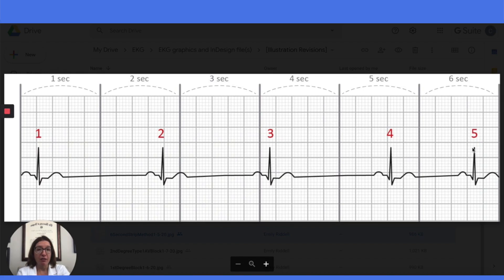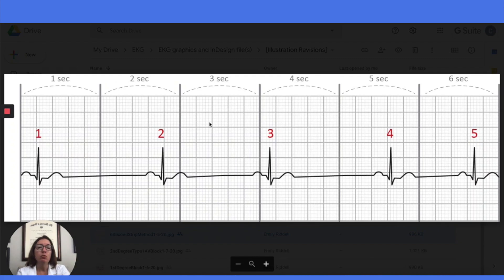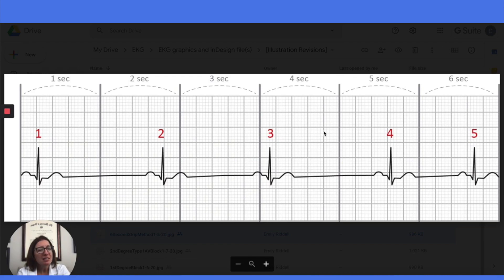I do want to offer one caveat. There are some sources and instructors who want you to count cycles as opposed to QRS complexes, which will in some cases give you a different result. If we were counting cycles, starting here — one cycle, two cycles, three cycles, four cycles, and a little bit — we would have just a little over 40 beats per minute. Most teachers and sources have you counting the number of QRS complexes, but you will need to clarify that with your particular instructor to see how they want you to calculate the heart rate with the six-second strip method.